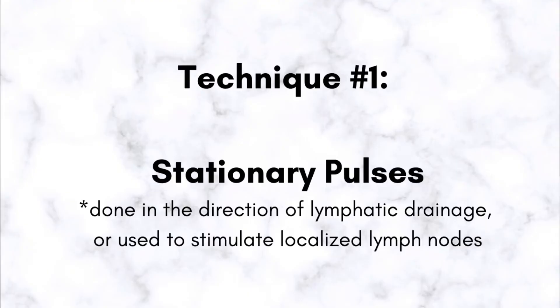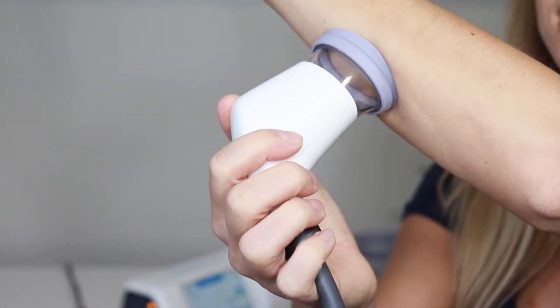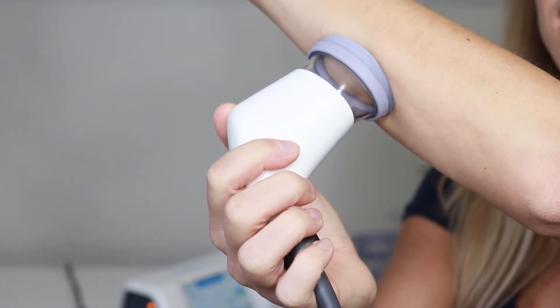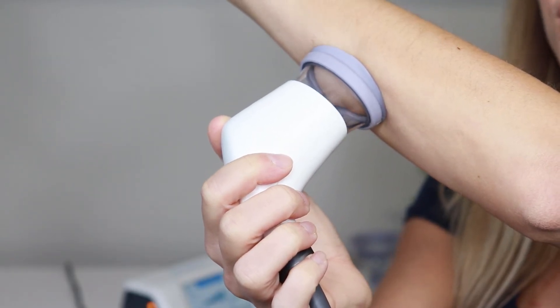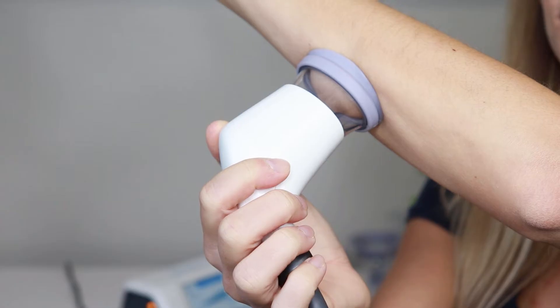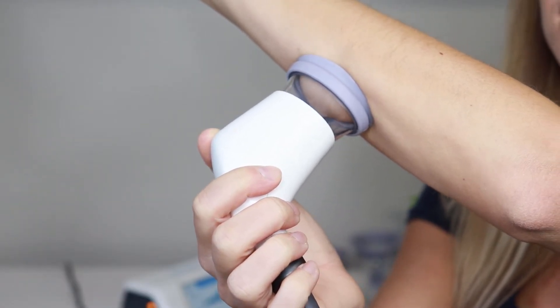One technique is just stationary — place it against the skin, it turns on, and you can see it suctions and pulses in place. We can change the amount of pressure, and that will be set for us on the protocols, because we want to make sure we're addressing the right thing.